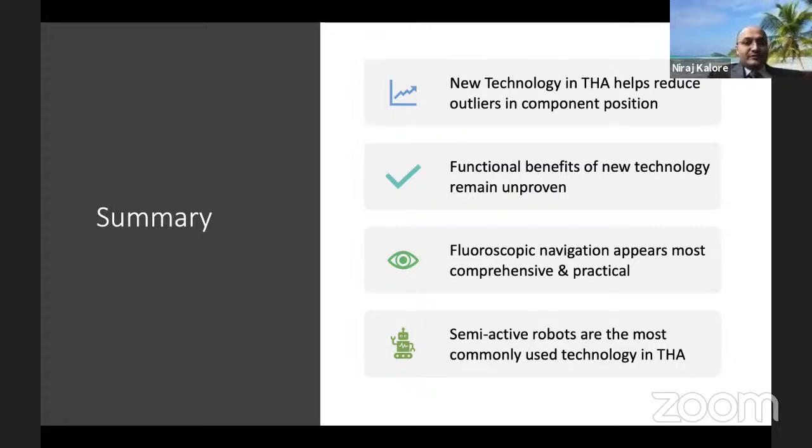And I think it will happen earlier in total knees and later in total hips, because the rate of satisfaction for total hips is so high. It's really hard to beat that. But the thing is, with all the other advances, everything else has literally been done. The rapid recovery, yes, that's one more thing that's happening now. But other than that, most of the avenues for advancement have been kind of explored. And that's why I think most of these companies are putting their R&D money in technology.